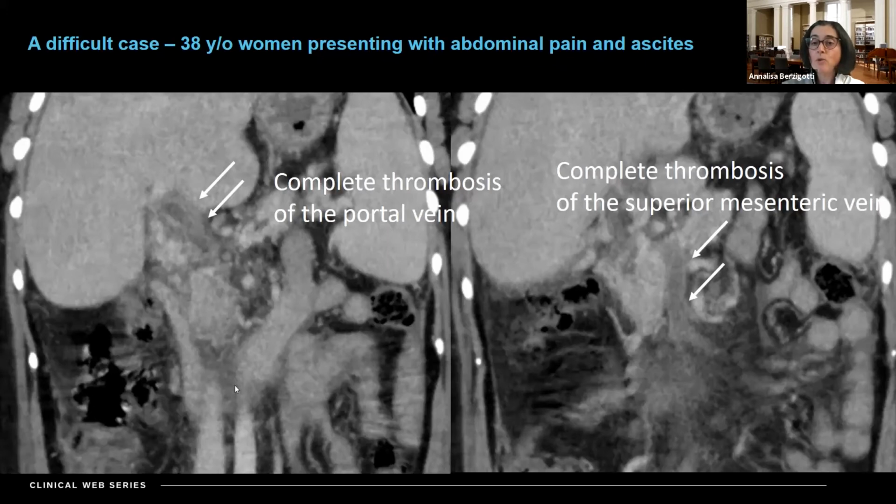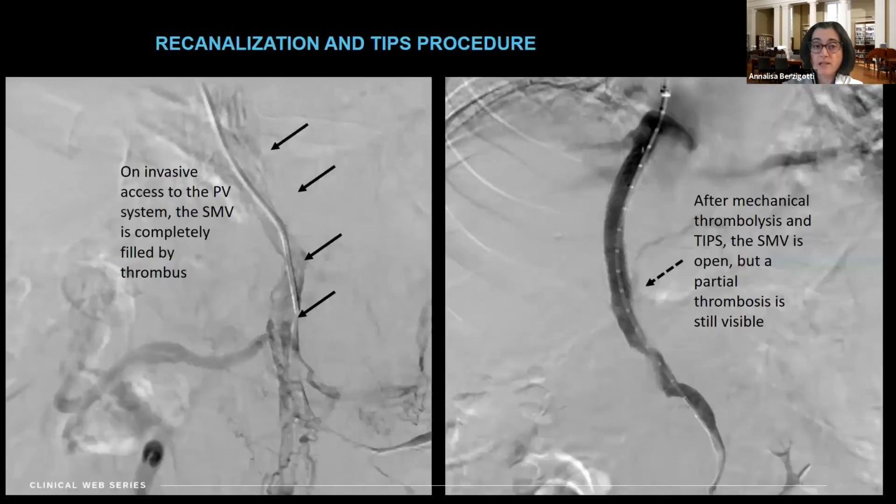After a few days of anticoagulation, since the symptoms did not disappear, we decided to go for an invasive recanalization of the mesenteric vein through a TIPS approach, given that the patient had also signs of chronic disease. And you can see that this is the access through a transjugular route. We could see angiographically that the thrombosis was very large. We put a TIPS in, we recanalized by mechanical thrombolysis and then thrombolysis the vessel.